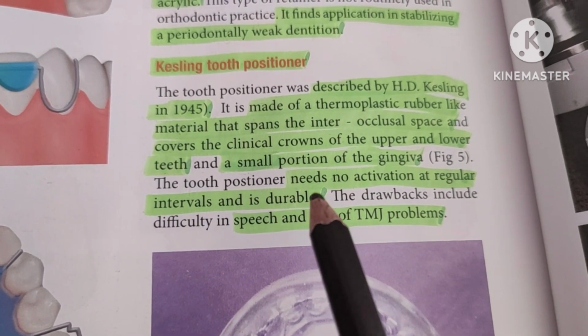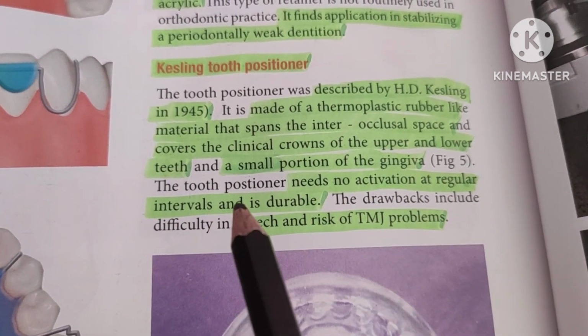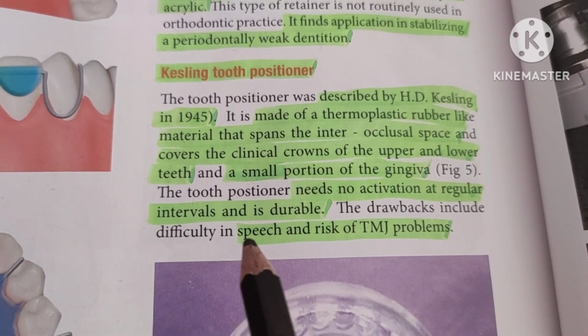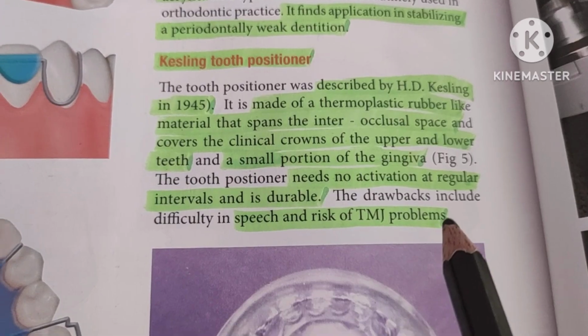The tooth positioner needs no activation at regular intervals and is durable. The drawbacks include difficulty in speech and risk of TMJ problems.